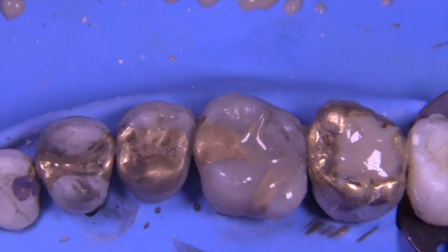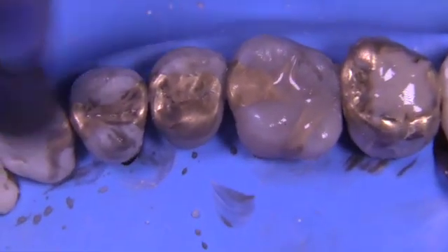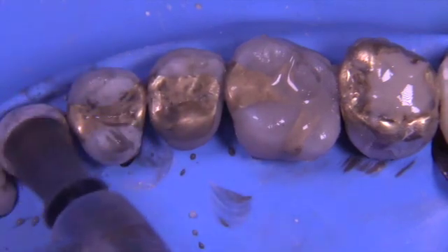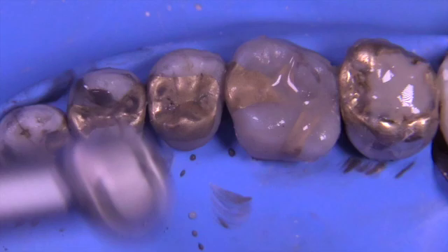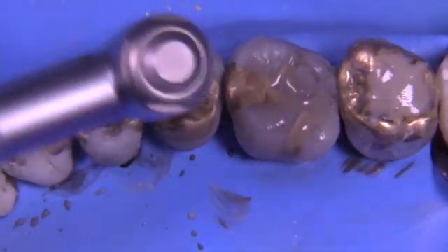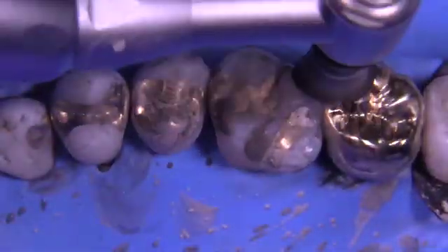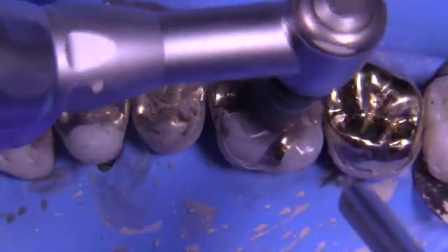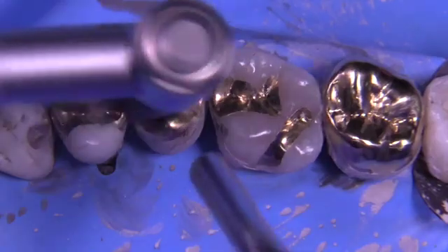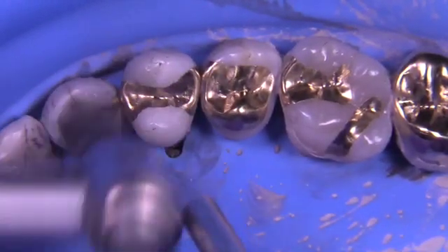It's a two-step process: application followed by evaporation. Step one — apply everything while the dental assistant stands by. Once you've got that matte finish and covered all surfaces, about five seconds per tooth, you're ready to have the assistant blow air while you go over the surfaces again very lightly. This is where you'll see the luster start to pop up — like polishing a car: you apply the paste, wait for it to dry, then buff it off. We're drying and rubbing it off simultaneously.